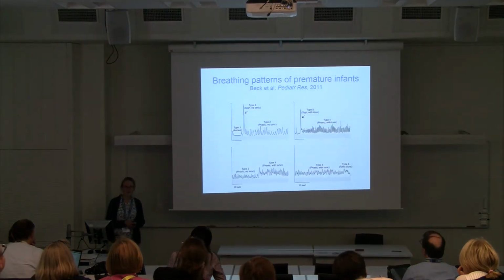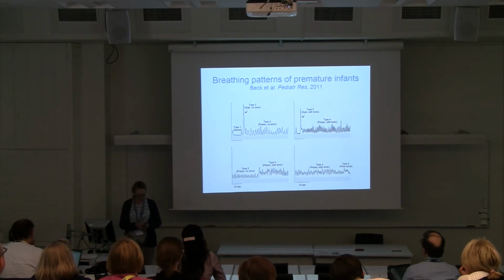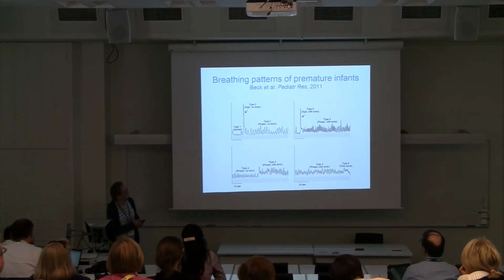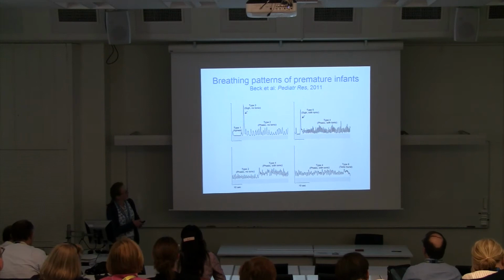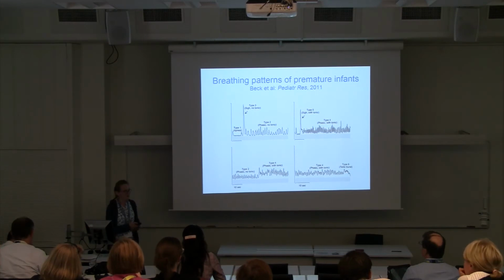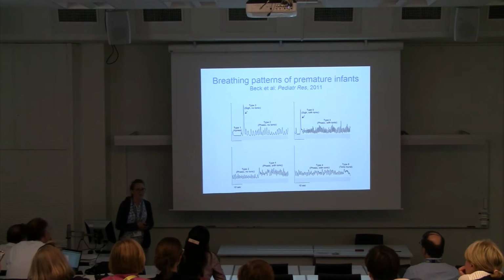And these breathing patterns have been described by Jennifer Beck. On this slide, you can see phasic breathing, no tonic activity. Here, phasic breathing with tonic activity when the diaphragm doesn't relax at end expiration. Also, apnea with a flat signal, and a sigh after apnea when the infant recruits the lungs.